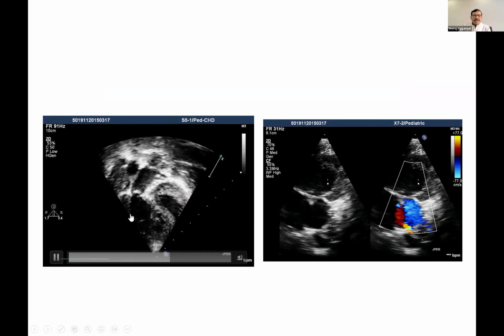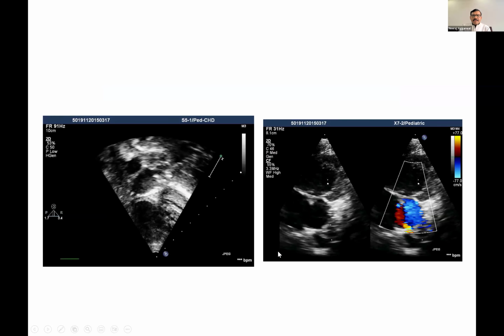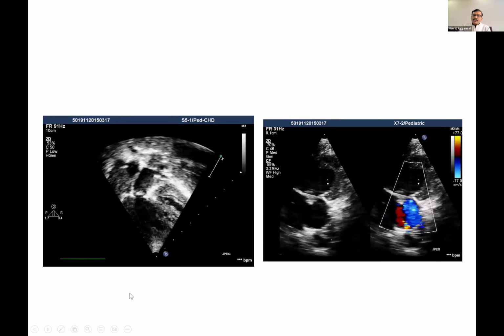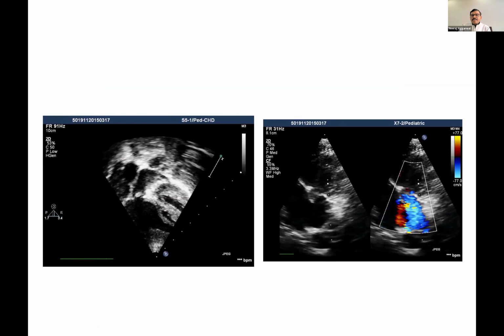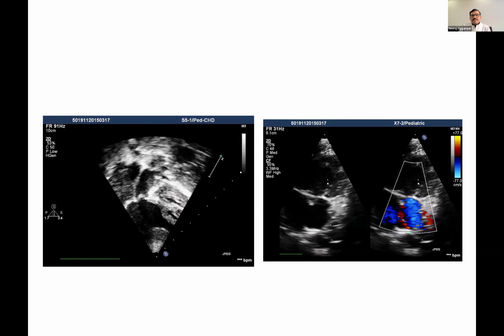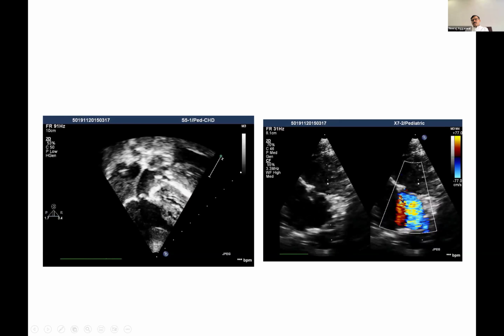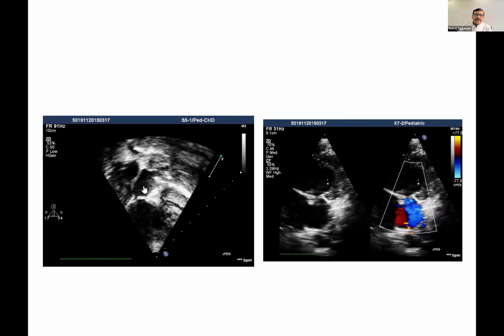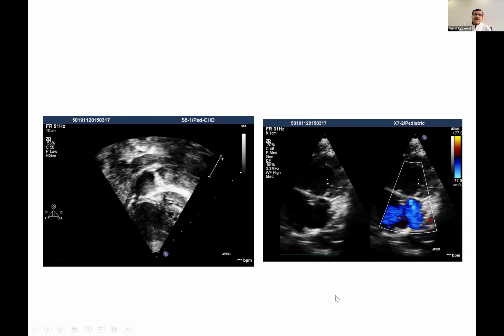This is to understand the pulmonary valve. The pulmonary valve had become calcified during fetal life, and there is barely any antegrade flow. It is a long time back case, around 2011, and at that stage we were saying if you find a PS patient, there is no need to follow up, since you are not going to do anything anyway. But now we tell them to come every 4 weeks to assess how much antegrade flow and how much RV function there is, so that you can take a decision on where to deliver.